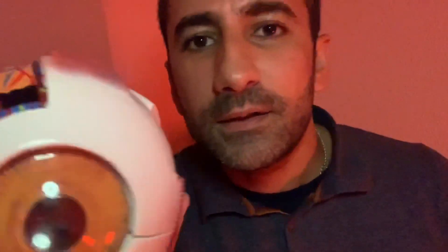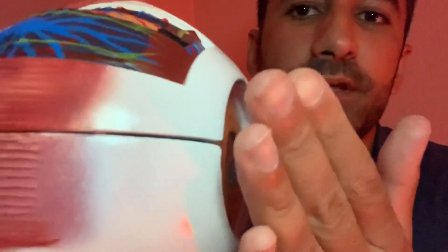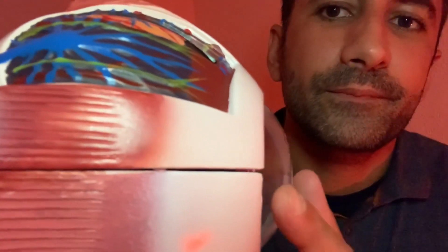Using the model eye here as a demonstration tool, we are going to be popping an eyedrop that's going to spread across the cornea — an eyedrop that is going to anaesthetise the cornea, so you won't feel any sensation for about 20 minutes. As the drop gets to work, we will be using a little applicator or probe to applinate the front surface of the cornea very delicately and for just a brief amount of time, and as contact is made I can then check the pressure reading using the tonometer.